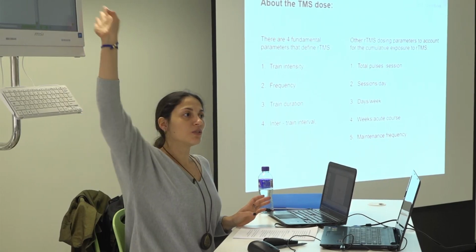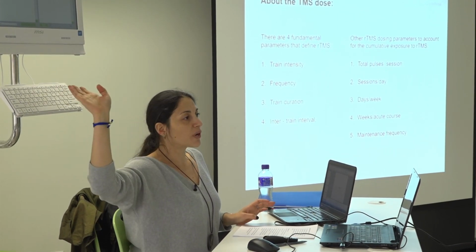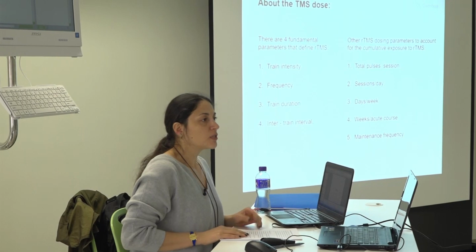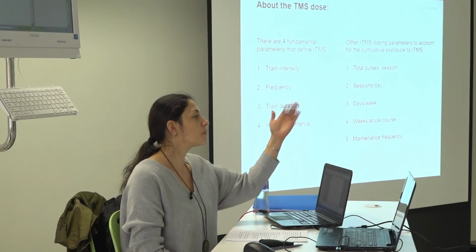And also you need to know that when you are going to use this machine to program your own protocols, you can program your protocols here. I'm not going to give you all the protocols because that's very easy to find online. If you are interested in a study where you want to study, I don't know, patients with anxiety, which are very few actually. So anxiety is not a good example. Depression, for example, and they are using a certain protocol.